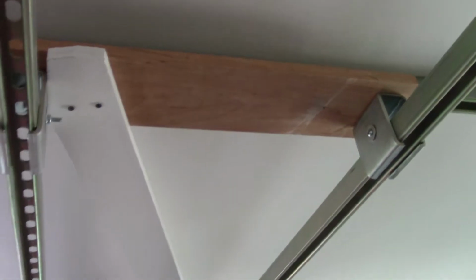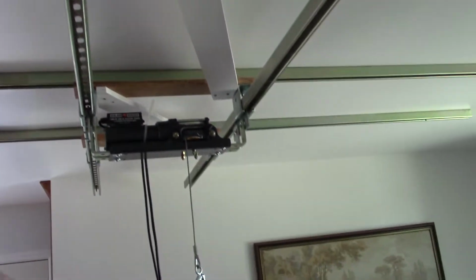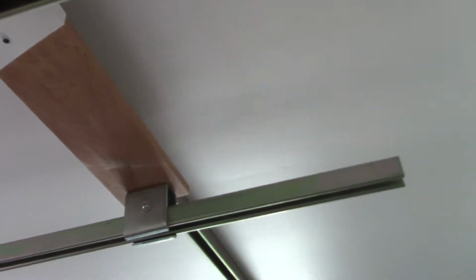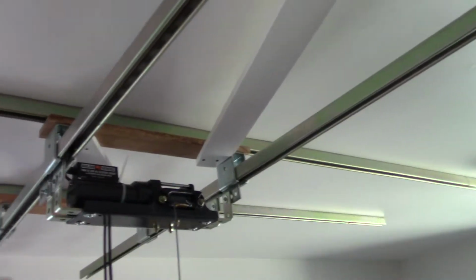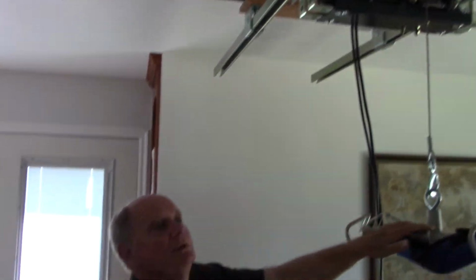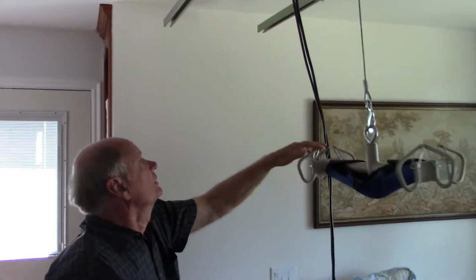And so there's one on each end, and then on this end we just got a bolt and put it down through the unistrut hole there so that it won't go off the ends on this end. We got the unistrut and screwed it into the ceiling on the trusses. So it's very strong. The trusses will certainly support Kristy's weight with no problem, and the unistrut crane with no problem.